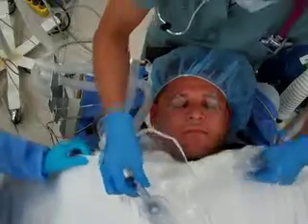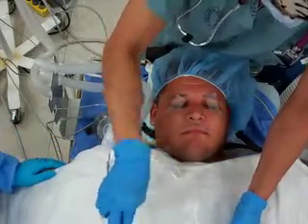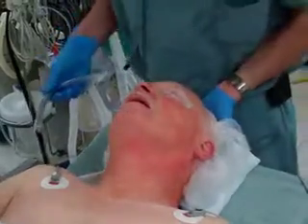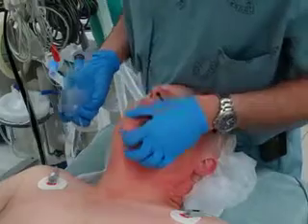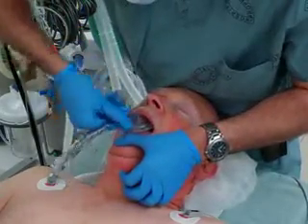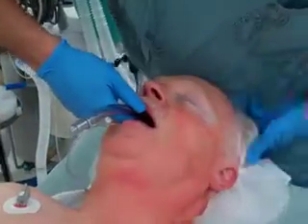The following sequences will demonstrate the placement of laryngeal mask airway in consenting adults undergoing elective surgical operations. With the patient in the supine position, gently tilt the head backwards to facilitate placement. Do not perform this backwards tilt in an unconscious patient in whom a neck injury is suspected.